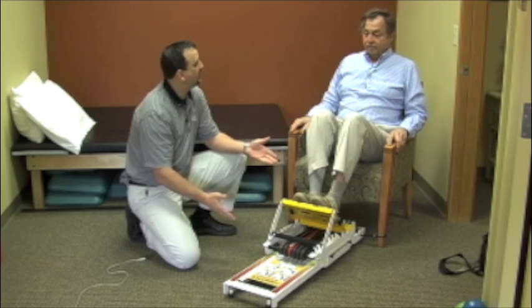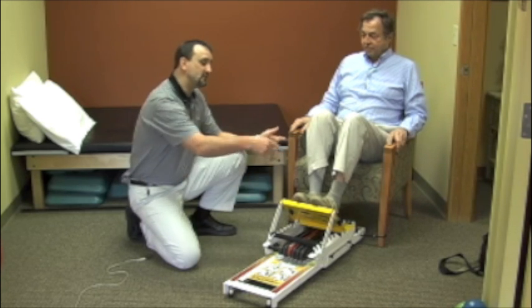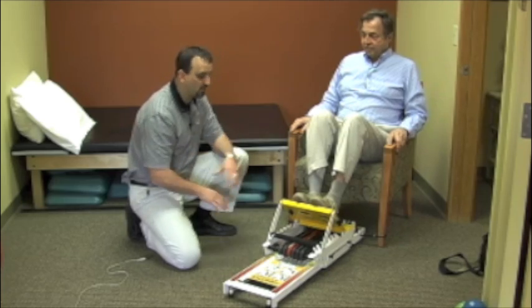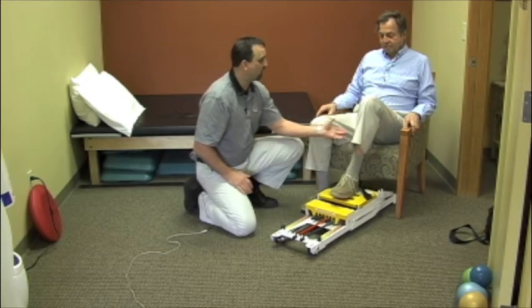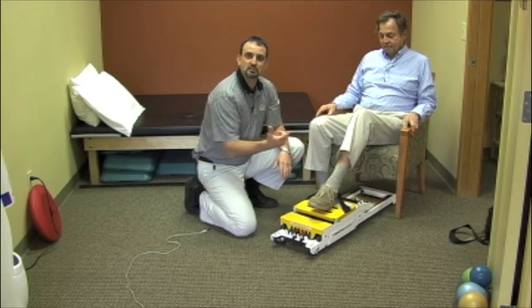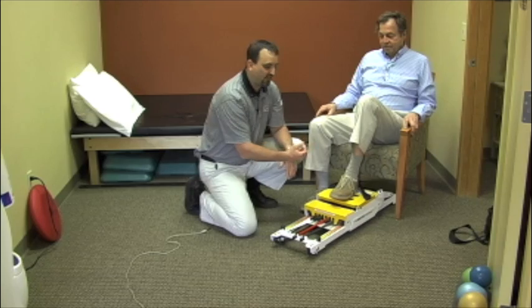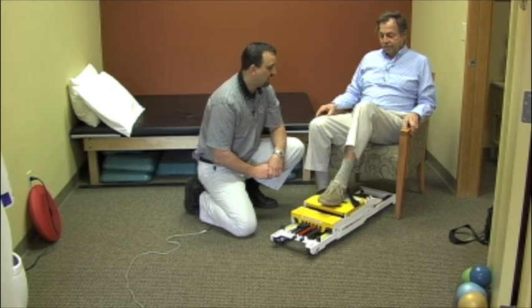We can also change the position of the Mini Press versus moving the client — we can change the position of the Mini Press and work a whole different set of muscle groups. From this position we're now working hamstrings in a shortened phase, in the concentric phase, as well as eccentrically working the hamstrings as they lengthen.